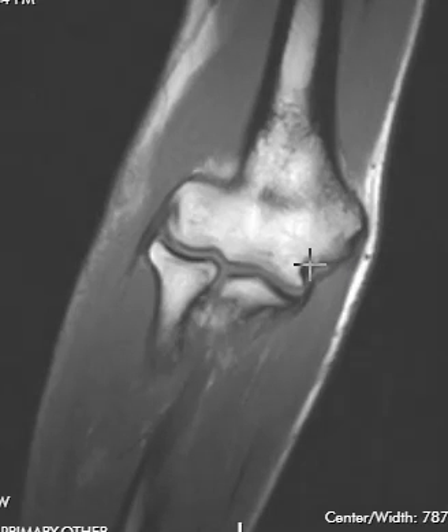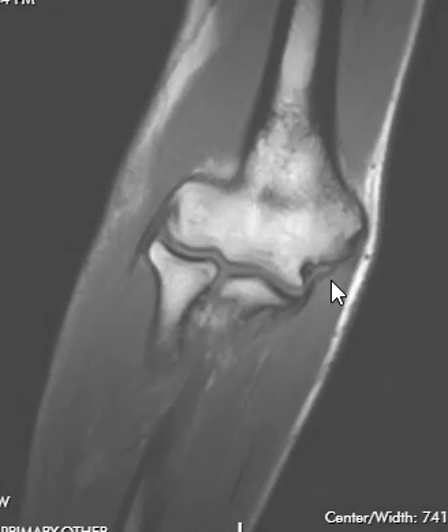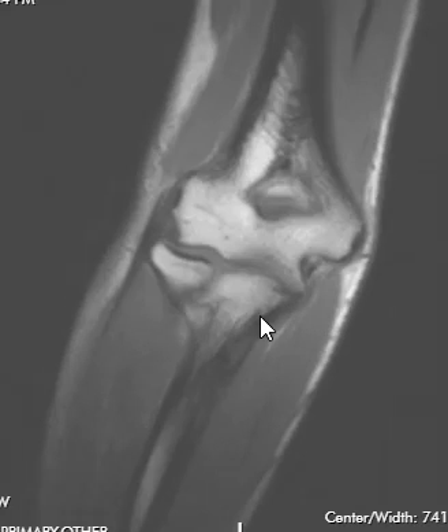The other thing we look for in this view is the ligament complexes. On the medial side we have the ulnar collateral ligament, which comes off the humerus here and runs down as a linear band, attaching on this little pointy part of the bone called the sublime tubercle.